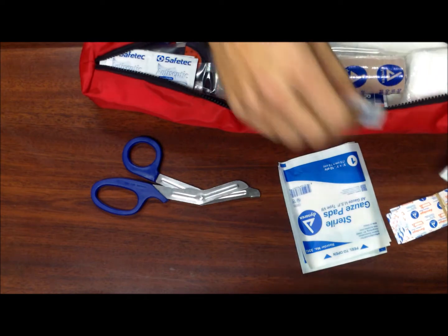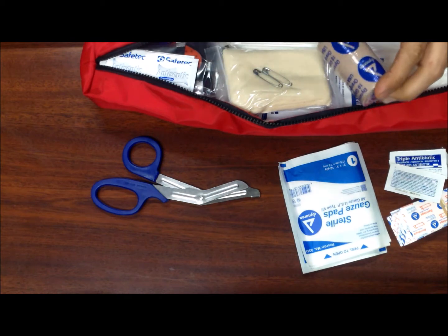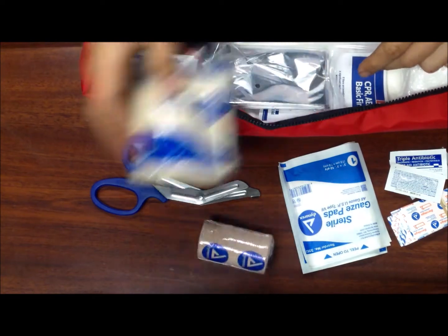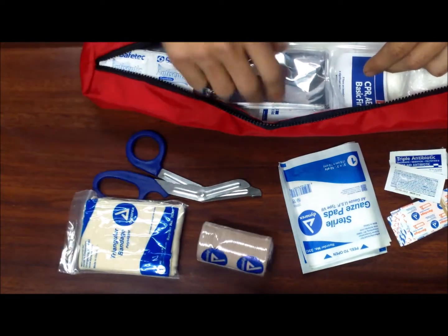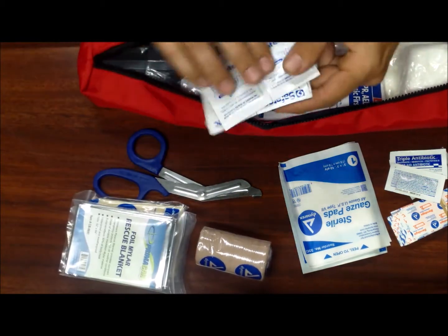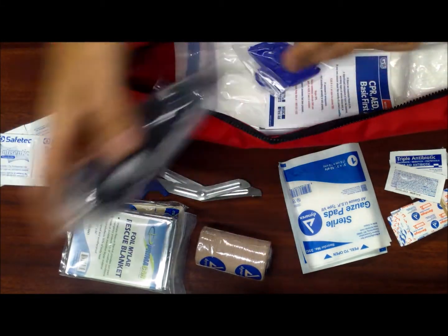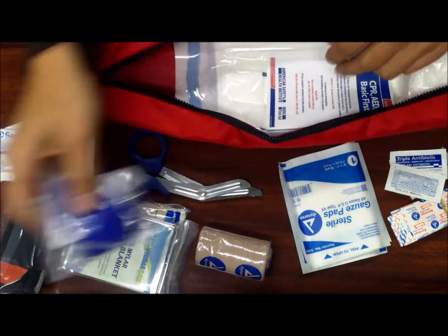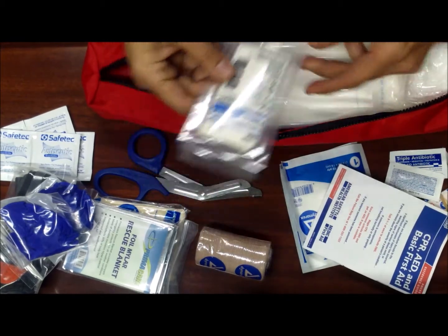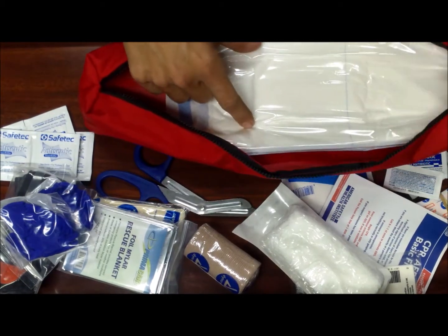We have some burn gel and antibiotic cream. There is a wrap to wrap up any kind of injury, a triangular bandage or shoulder bandage for dislocation or tears of the shoulder, a rescue blanket or emergency blanket. We have antiseptic wipes to clean your hands, a tourniquet with instructions, two sets of gloves, a first aid and basic CPR guide, steristrips, an acrylic gauze wrap, and a giant abdominal gauze pad.